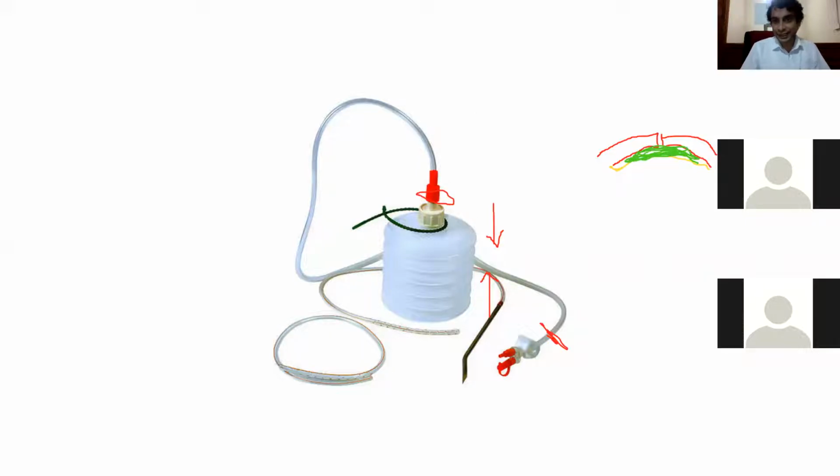Now, if we let that just wait without putting suction, and if we just close the skin here at the end, we get serous fluid accumulating as an exudate in this area. We call that a seroma, right? So you can have seroma formation sometimes when you make subcutaneous large incisions and skin flaps. So to prevent seromas from forming, we can put a suction drain into this space and close. So that's another example of the kind of drains that we insert.